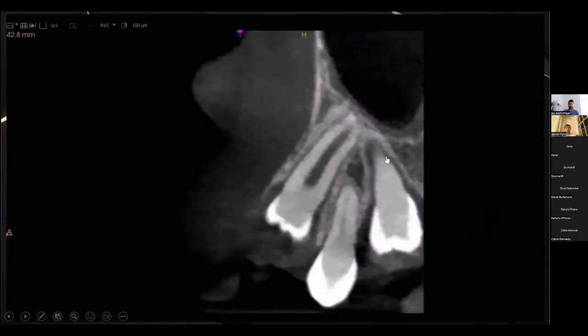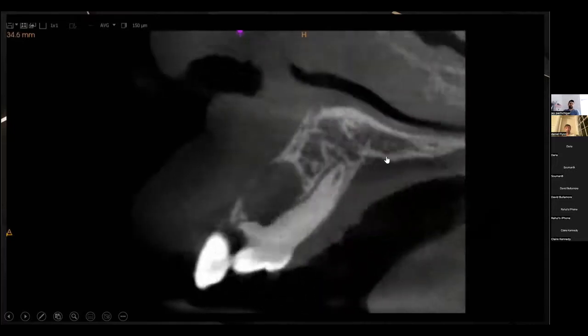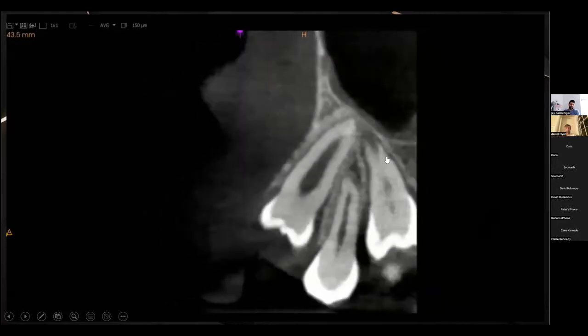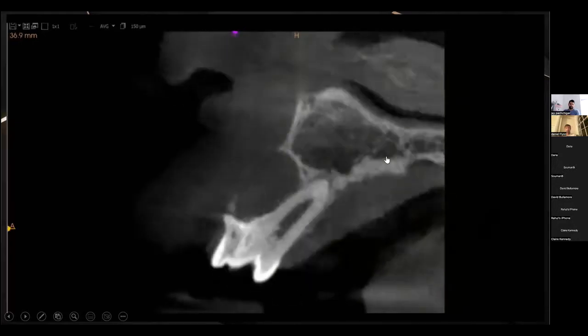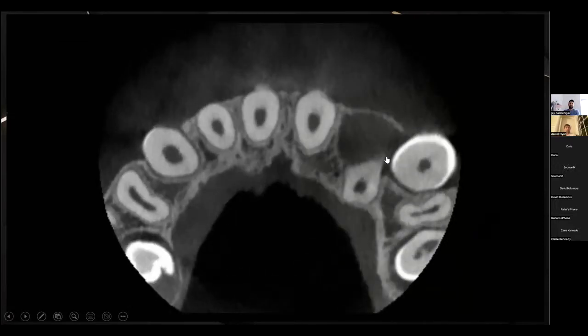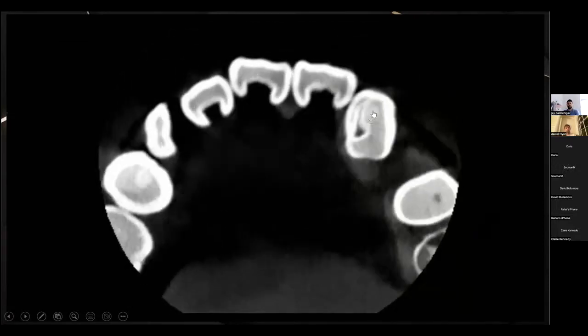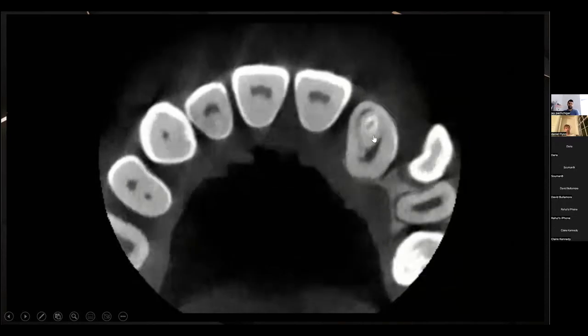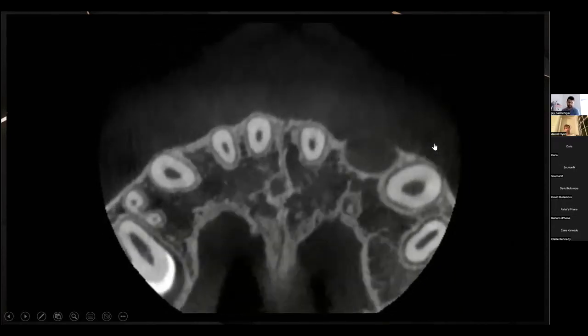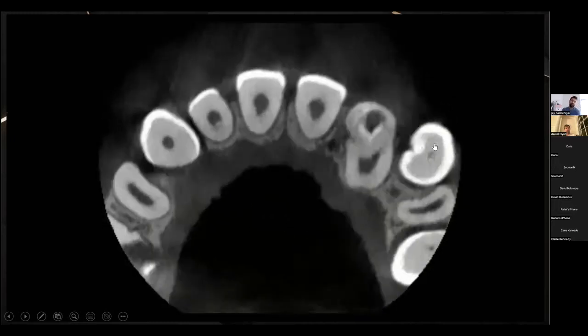So again, just another case here, and this was I think a 12 or 13 year old. You've got the dens invaginatus over here, quite a big lesion. You see you've got that perforation buccally over here. As soon as we've gone in, it's only a couple of millimeters, and we can see the perforation buccally. And again, a very wide canal.